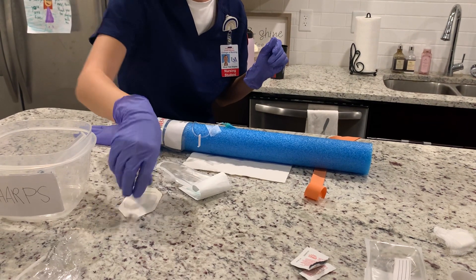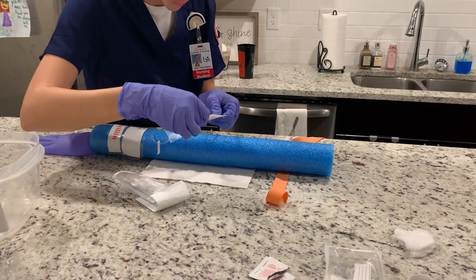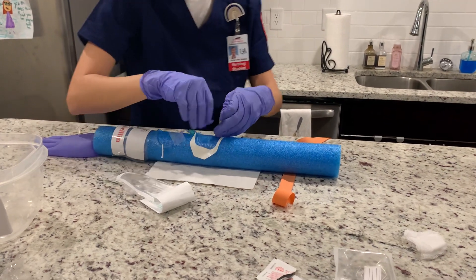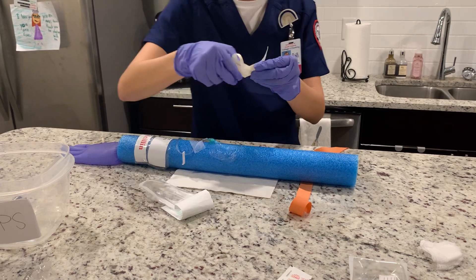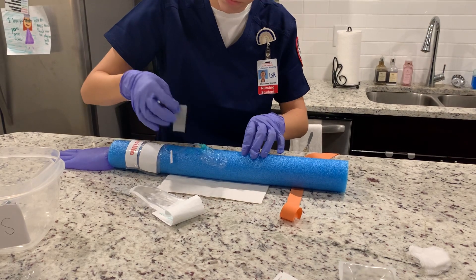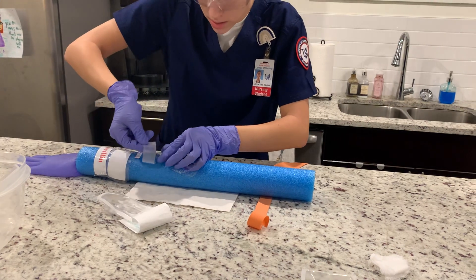Now I'm going to take my Tegaderm, remove the lining, and place it all the way to the hub. I'm going to gently remove the wrapper, discard that, remove the temporary tape, and secure the Tegaderm to the patient.